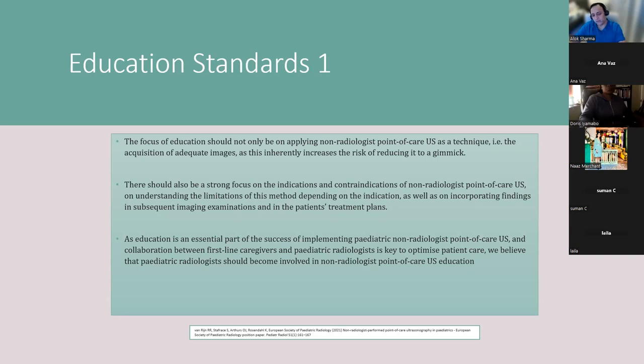So I know for a fact that when I wrote the guideline for Southampton, we agreed that we would not be using lung ultrasound scores for the purpose of diagnosis and management of RDS. And the reason for that is we electively intubate a lot of our babies under 26 weeks. We have a high PEEP failure rate. For that reason, if you're already going to give them surfactant, and the evidence is not out there for the second dose, and we don't have high quality evidence to guide us about that, why would you then use lung ultrasound scores in that context?